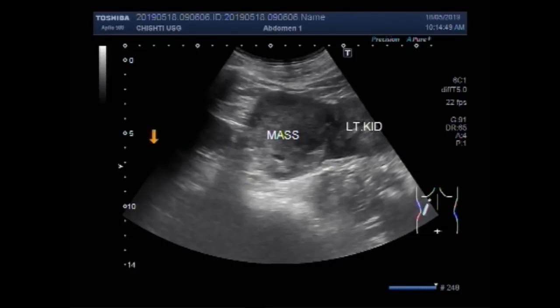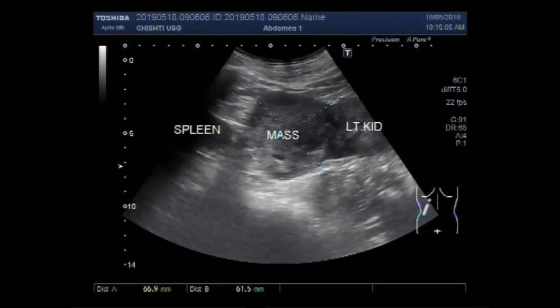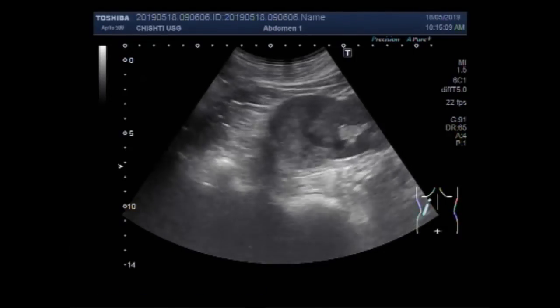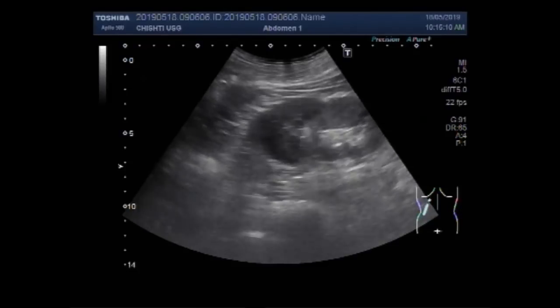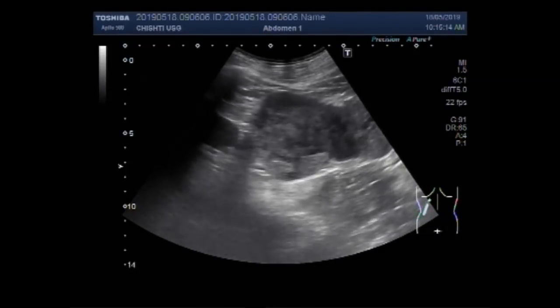This is the left kidney and this is the mass. And this is the spleen. You can see a round to oval shaped mass measuring about 6.7 cm by 6.2 cm. The mass is semi-solid to solid in consistency with heterogeneous echogenicity.